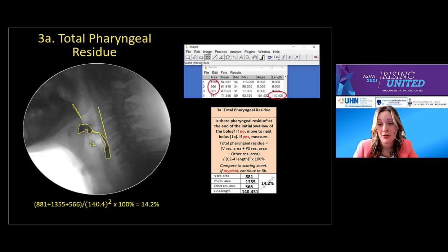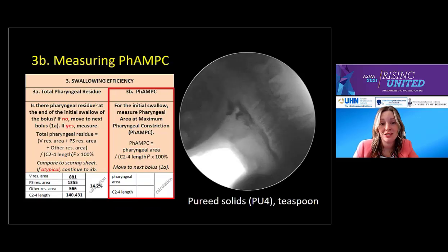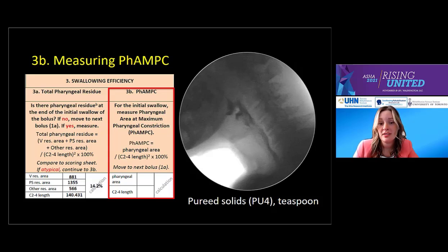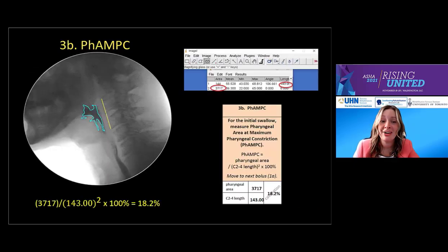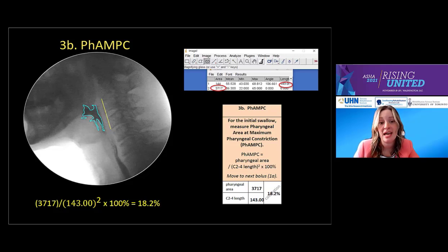Knowing his total pharyngeal residue was atypical at 14.2%, we want to look at 3B — pharyngeal area at maximum pharyngeal constriction — to understand if it was a potential contributing mechanism. This is defined as the area of unobliterated visible airspace and/or bolus at the height of the swallow, measured on the first swallow in the sequence, normalized to the patient's anatomy with the C2–C4 scalar. Pharyngeal area at maximum constriction is traced in blue. Based on our calculations, this gives 18.2%. The normal reference value for this parameter on pureed boluses is less than 1.4%, so our patient is considered atypical, suggesting reduced pharyngeal constriction as a contributor to impaired swallow efficiency.